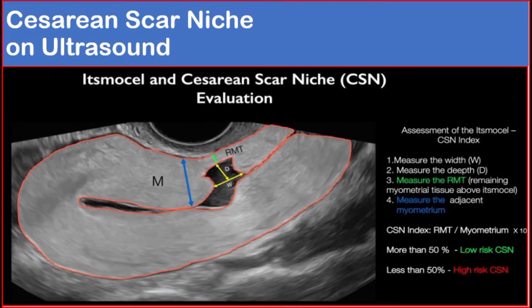This is a picture of caesarean scar niche on ultrasound, showing how to do assessment of the isthmocele by caesarean scar niche index. Number one, measure the width (W). Number two, measure the depth (D). Number three, measure the RMT, which is the remaining myometrial tissue above the isthmocele. Number four, measure the adjacent myometrium. The caesarean scar niche index is the remaining myometrial tissue divided by myometrium thickness, multiplied by 10. More than 50% is low risk; less than 50% is high risk caesarean scar niche index.